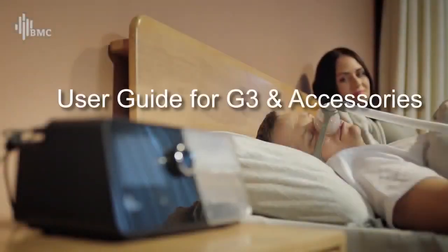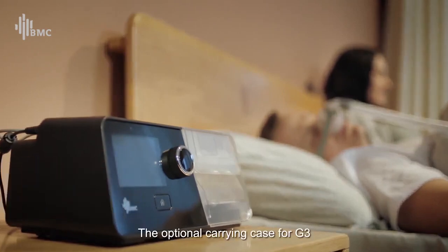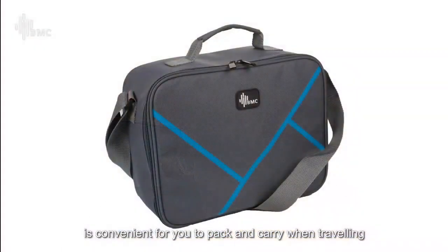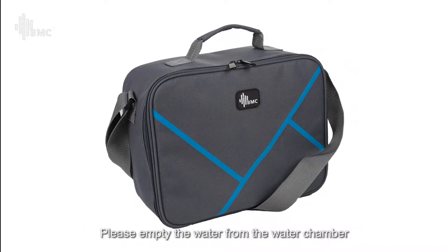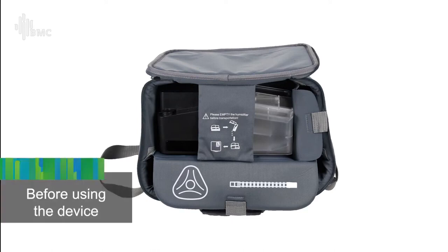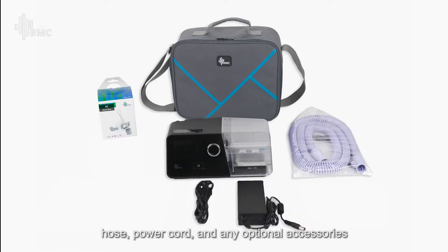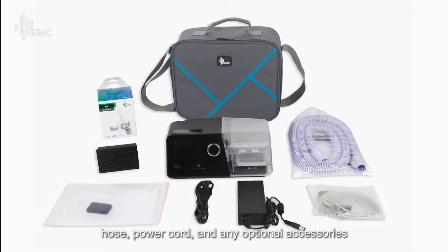User Guide for G3 and Accessories. The G3 device. The optional carrying case for G3 is convenient for you to pack and carry when traveling. Please empty the water from the water chamber before packing the device. Before using the device, open the carrying case and remove the device, hose, power cord, and any optional accessories.